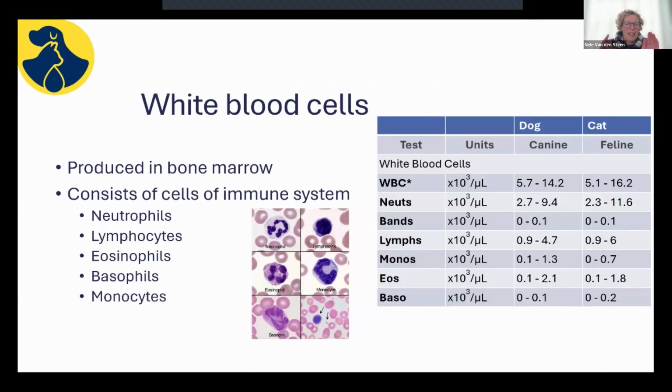We're not going to talk about treatment of polycythemia because otherwise we'll be here the rest of the day. Okay, white blood cells. Let's go through these briefly. When we look at our white blood cells, they are obviously composed of your neutrophils, lymphocytes, monocytes, eosinophils, and basophils. As we said, in a minute we'll talk about platelets.